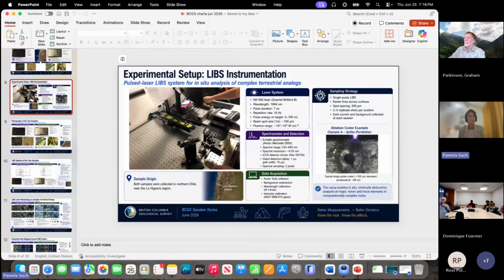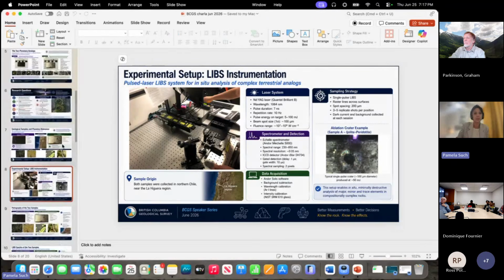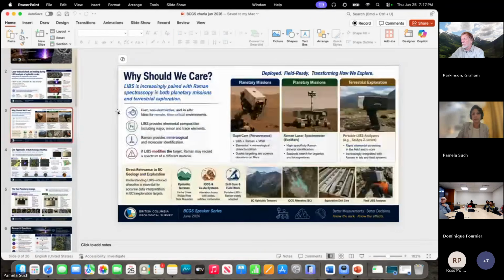Maybe it won't be representative enough to give it any importance, but maybe you were shooting the whole vein and then you send it to the lab, and then you will have, oh, why are there granites here? It shouldn't be here, right? So I would personally use 5% energy, but maybe it's preset.